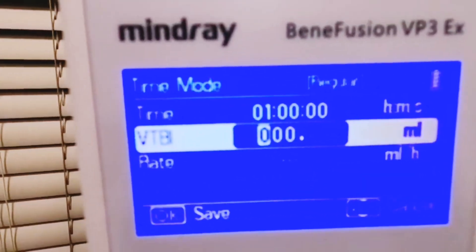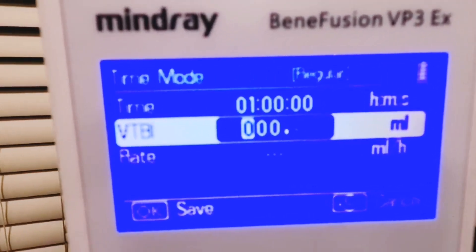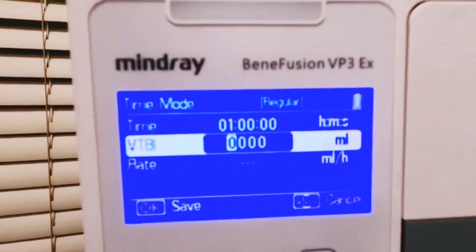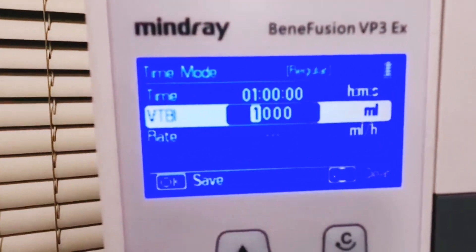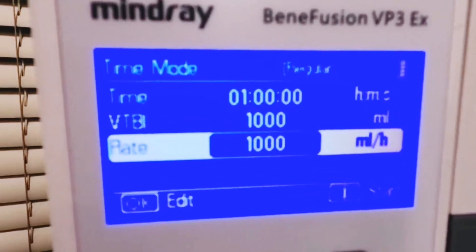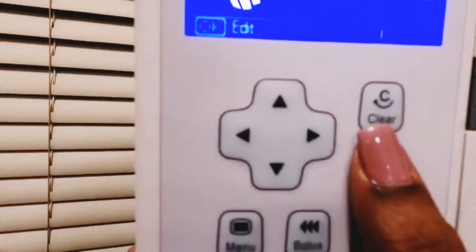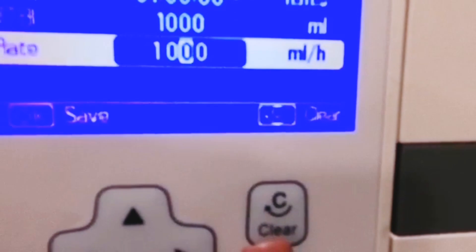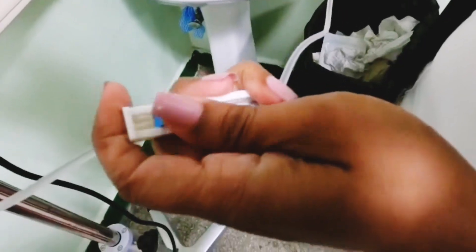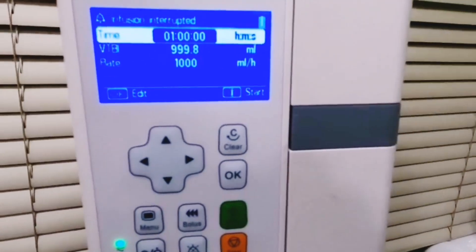The fields are set in hours, minutes, and seconds. For the volume of one liter, press the arrow to the side to move to the next parameter, press one, then press OK. The rate will automatically calculate. After pressing OK, press start. Then release the clamp and the infusion will begin.